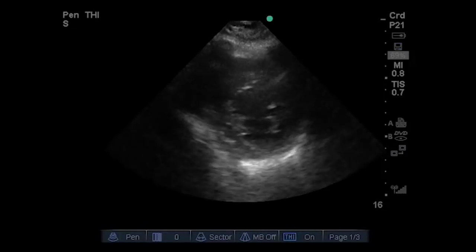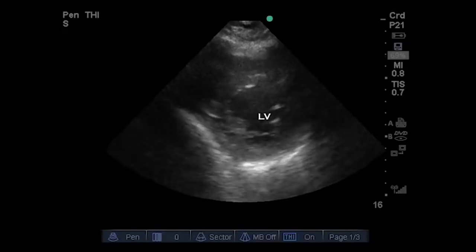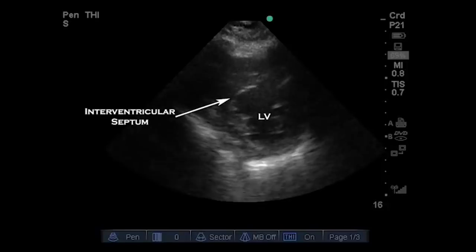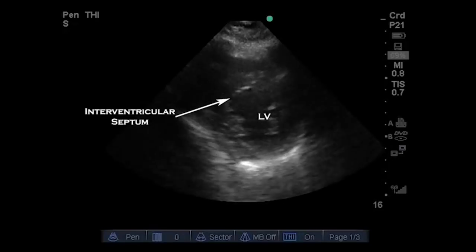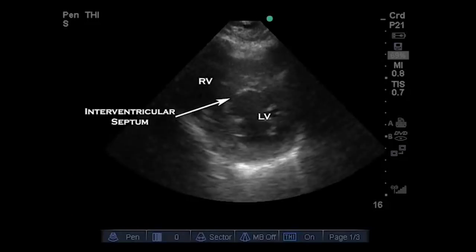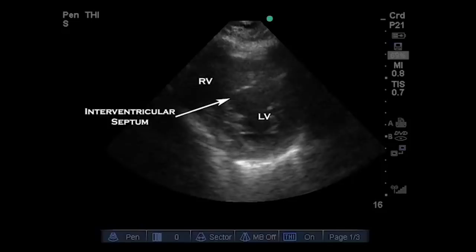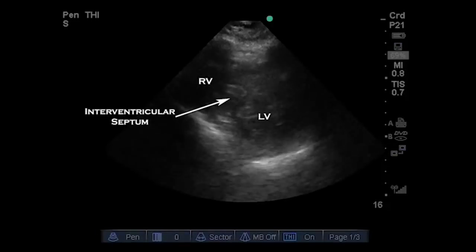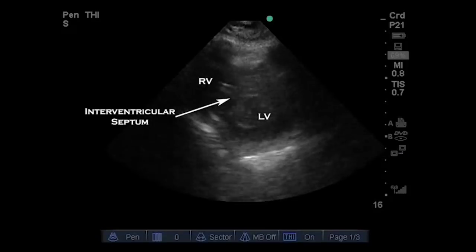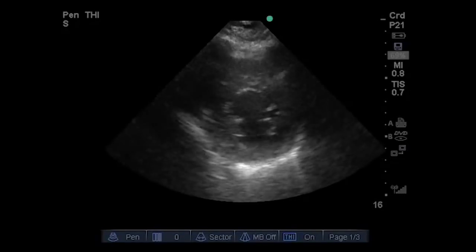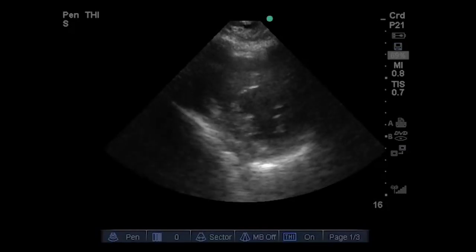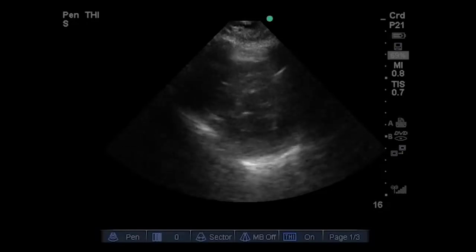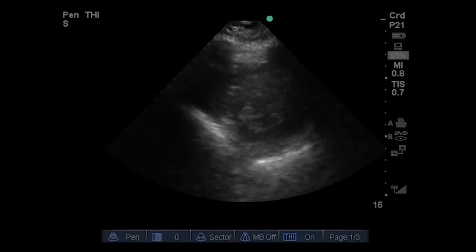This view identifies the left ventricular cavity, the septum, and the pericardial area, which is circumferential to the heart. The RV — the right ventricle — is not seen in its entirety because a rib shadow blocks visualization of the right ventricular free wall. The right ventricle is though crescent-shaped, which would be typical of the normal right ventricle.